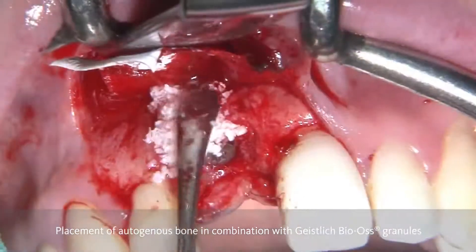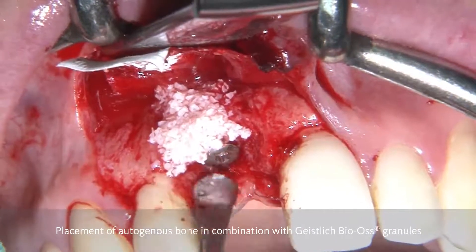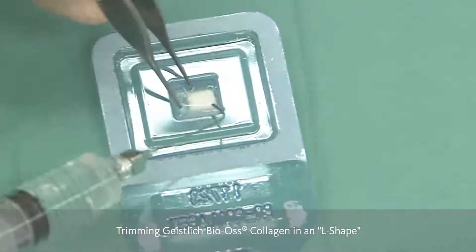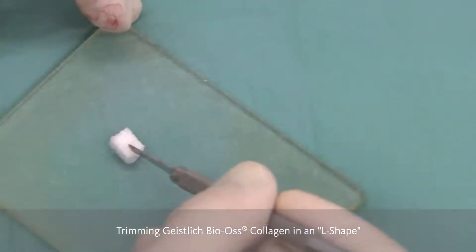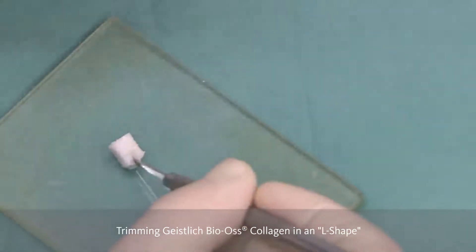In order to cover the exposed implant, we are going to place autogenous bone either with or without the Bio-Oss granules. And this is the bone regeneration part. But now, in order to further advance one step in the aesthetic area and do a bone contouring, we are using the Bio-Gide collagen and shaping it according to an L.